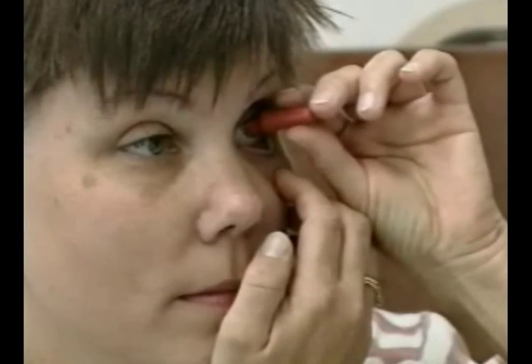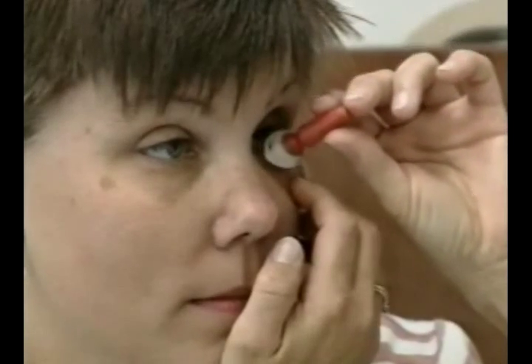Next, release your upper lid and gently pull your lower lid down, exposing the rim of your artificial eye. Using the suction cup, gently tilt the eye up so as to lift the lower edge over the lower lid. Once the lower edge has cleared the lower lid, you should be able to slip the artificial eye out by drawing the artificial eye down and out over the lower lid.